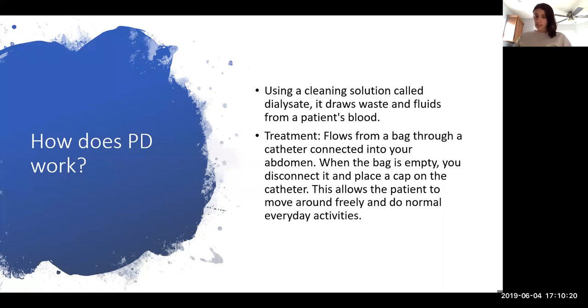When the bag is empty, you disconnect the catheter at one of the ends, and you place the cap on the catheter so that the fluid actually stays in for a little while. This allows the patient to move around freely and do normal day-to-day activities. You can watch TV, you can walk around, anything like that.